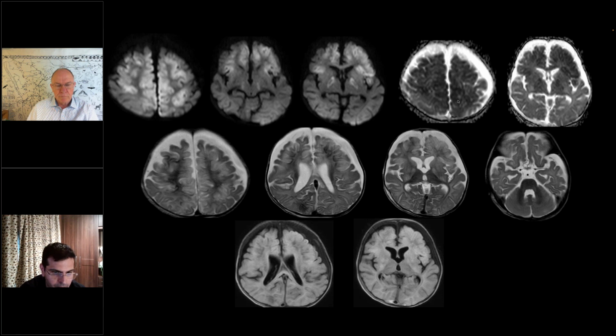Somehow at this age group, between 6 to 12 months, because of the problem with the brain, it looks like a metabolic disorder, but it is not, because there is always cortical involvement as well at the border zone area with the globus involvement. I've had patients with globus and midbrain involvement, which looks more like a metabolic disorder, but they had an acute hypoxic insult. So this is not suggestive of a metabolic disorder unless the liver dysfunction persists. If liver dysfunction improves, that means it was a post-ischemic liver dysfunction.